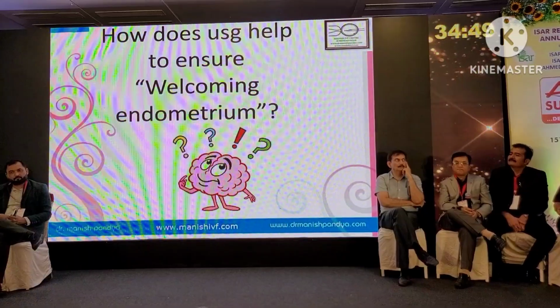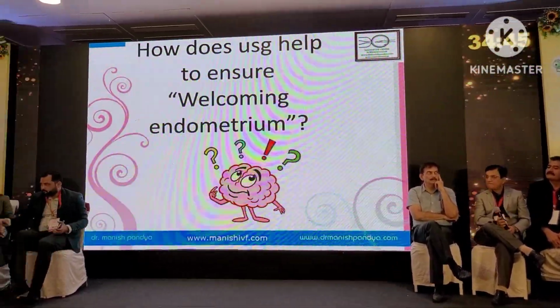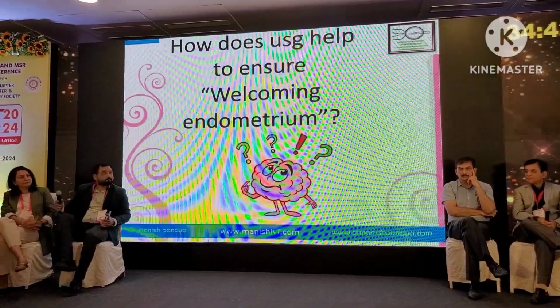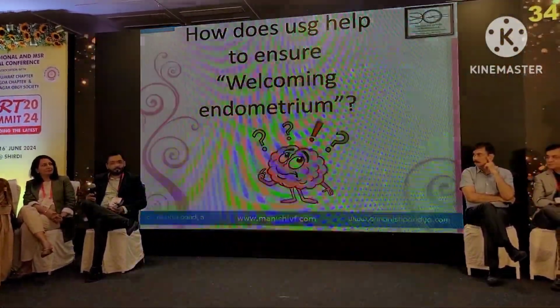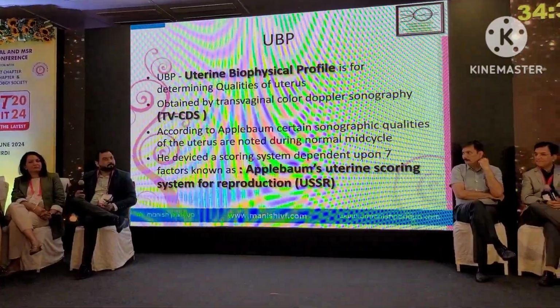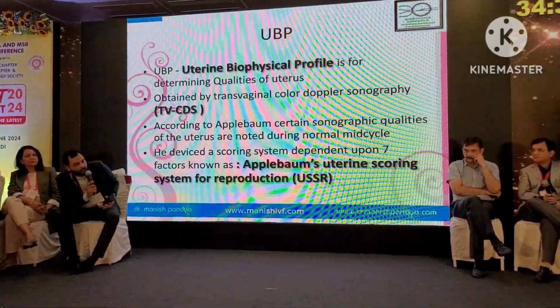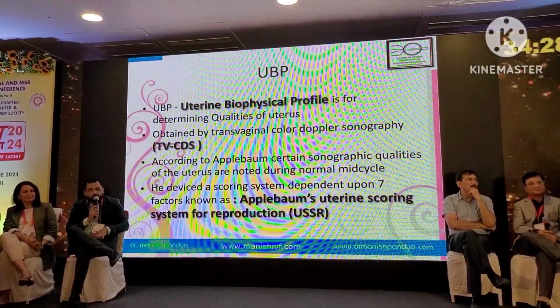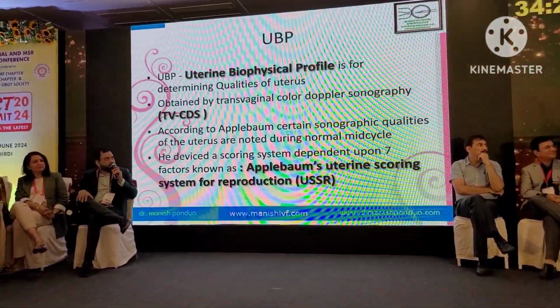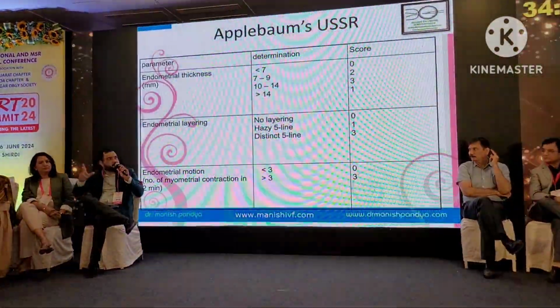How does ultrasound help to ensure a welcoming endometrium, sir? Now you have to welcome the endometrium. She had already mentioned Applebaum. Vascularity, Applebaum. There are so many criteria: thickness, the layering and the motion. Now all three things should synchronize.